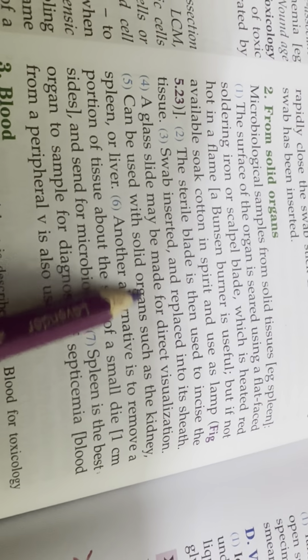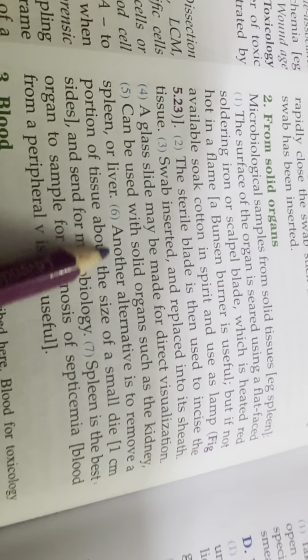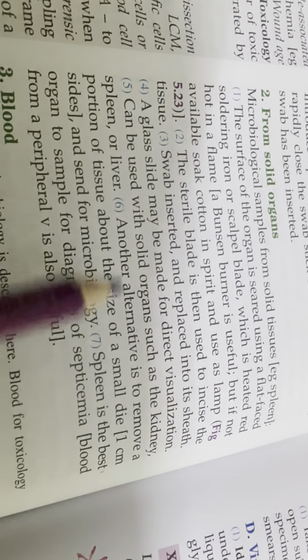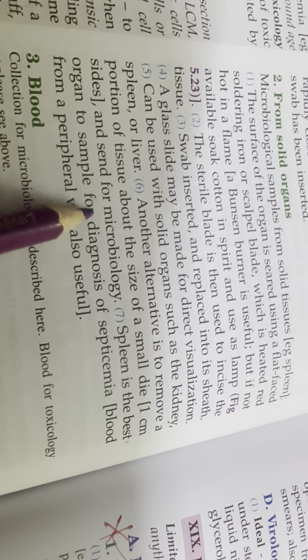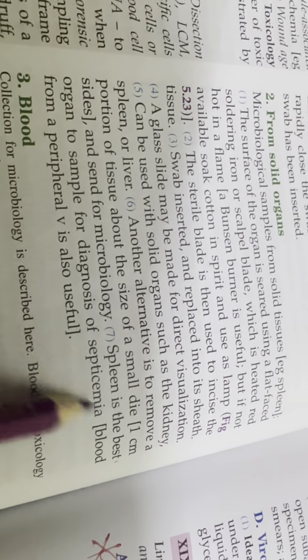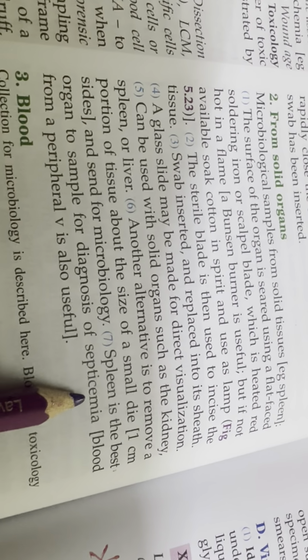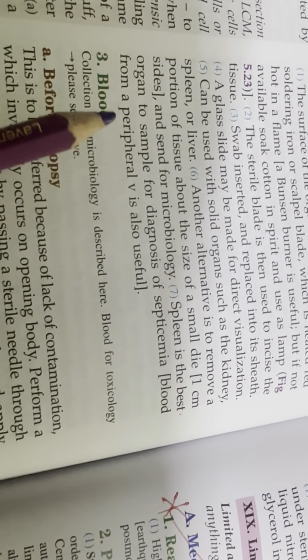A glass slide may be made for direct visualization, and can be used with a solid organ such as kidney, spleen, or liver. Another alternative is to remove a portion of tissue about the size of a small die, 1 centimeter a side, and send it for microbiology. The spleen is the best organ to sample for diagnosis of septicemia. Blood from a peripheral vein is also useful.